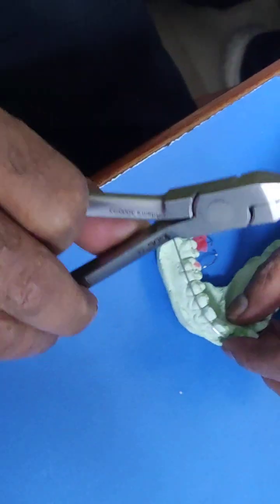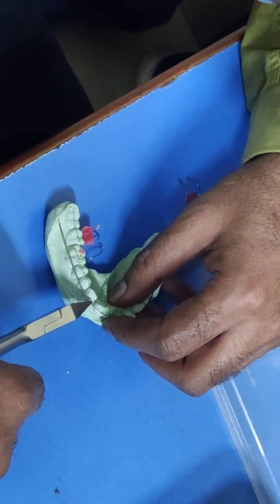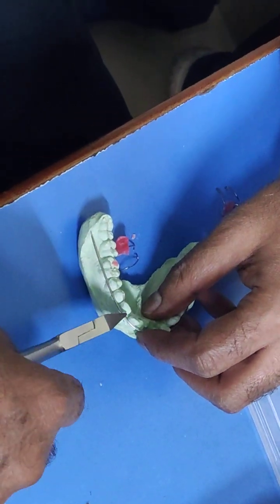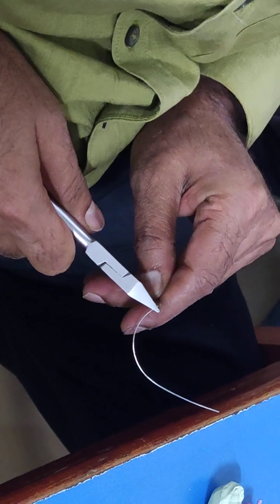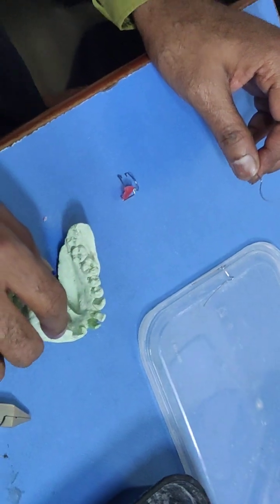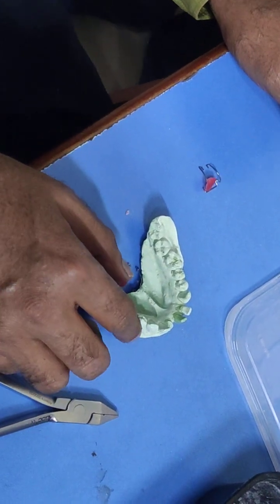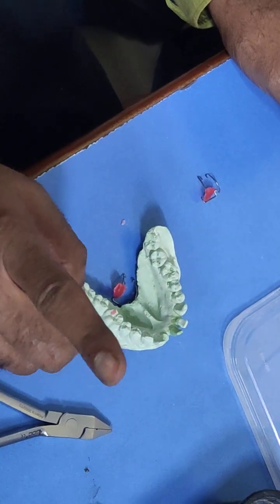So first hold the wire for the U-loop bend at the mesial end of the canine. As this is so, we make a small U-loop labial bow. We don't need a large U-loop labial bow. If there was space also distal to canine, then we could make a long U-loop labial bow. In that case, the U-loop bend will be from the mesial end of the first premolar.